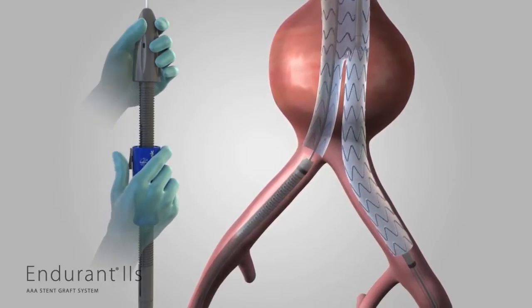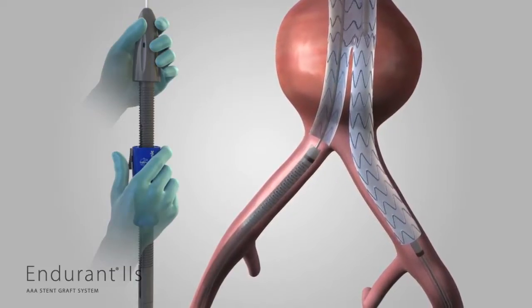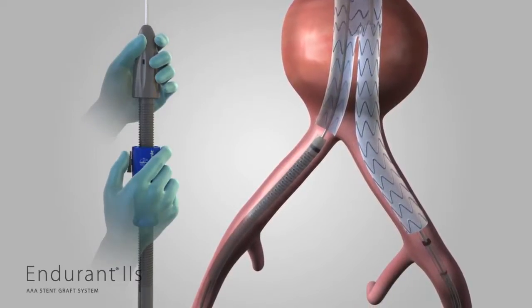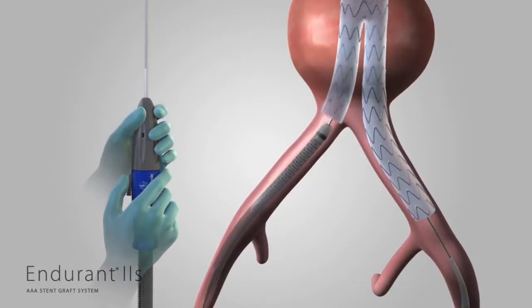To configure for removal, continue to hold the delivery system with one hand on the front grip and the other hand on the slider. Pull back the slider trigger and hold the slider stationary while bringing the front grip to the slider. Gently remove the delivery system using fluoroscopy to ensure that the stent graft does not move during withdrawal.